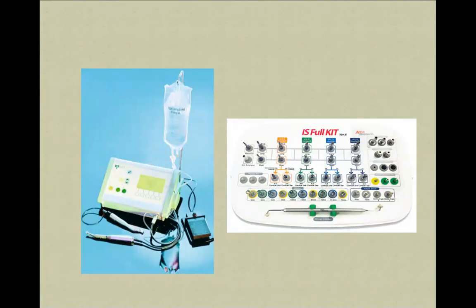But once you're doing implant placement, you need 2 general things. Well, first, it is a set of drills, and the second is a physio dispenser. Well, let us start from the set of the drills.